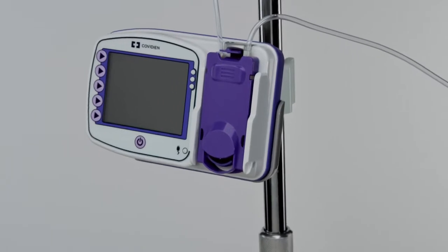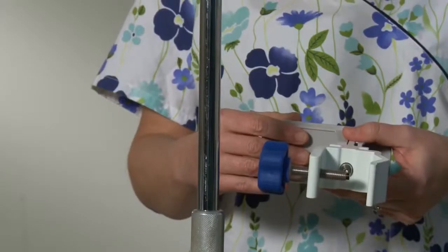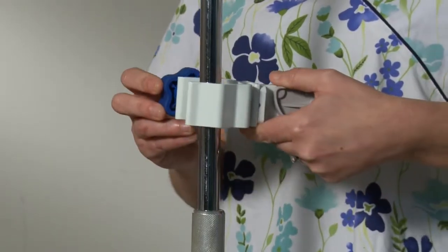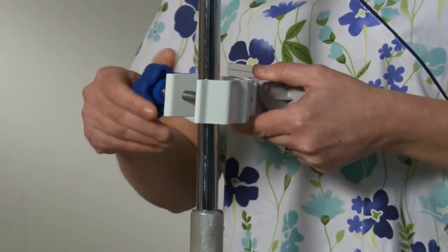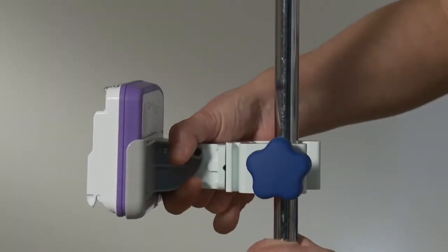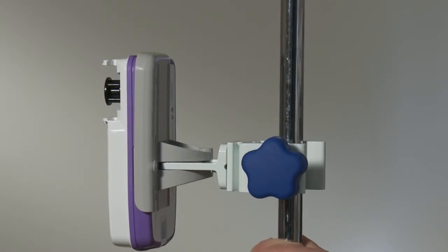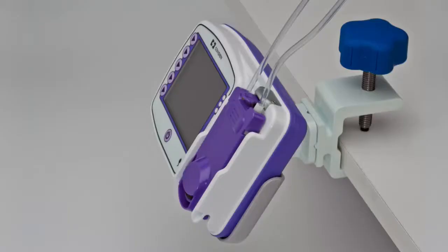The Kangaroo Connect enteral feeding pump can be attached to a vertical pole using the pole clamp included with the pump. Tighten the knob so the pump does not slide down the pole. The plastic retention plate is designed to be rotated in 90-degree increments to allow attachment to a horizontal tabletop surface or a horizontal bed rail.